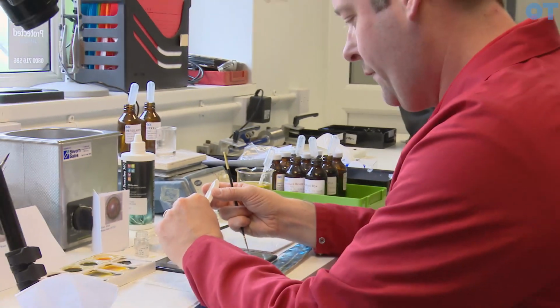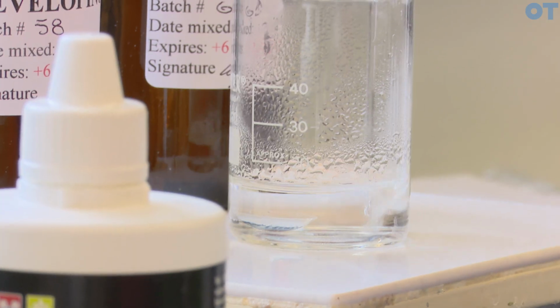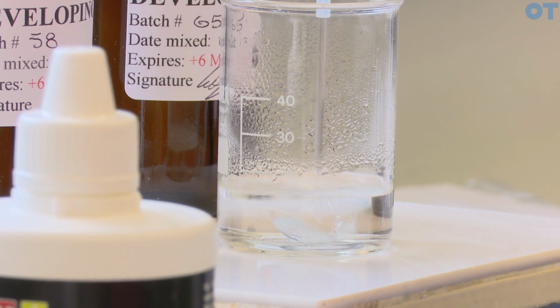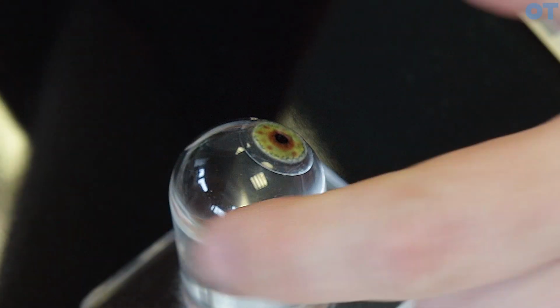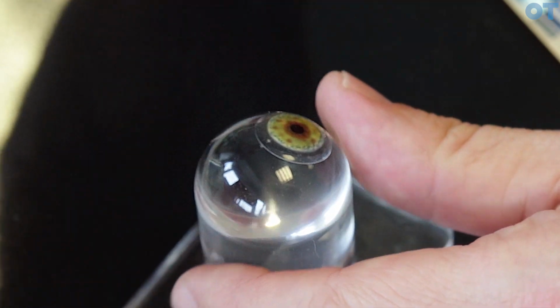So now what I do is I develop what I've painted so far just to see what the colour's going to be like, because as I'm painting you don't see the colour until you've developed it. So you're predicting how the colour's going to look on the lens as you're painting it. It's not there right in front of you straight away. I think the longest learning curve in all of this is using these dyes and predicting how they're going to change when you use them.